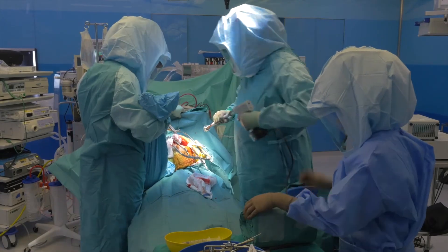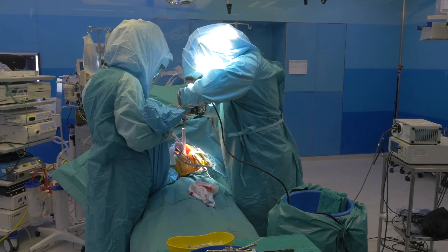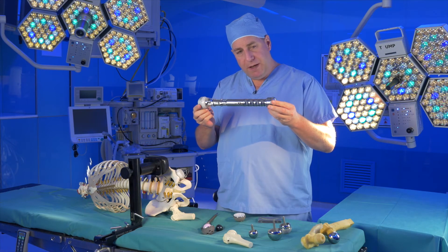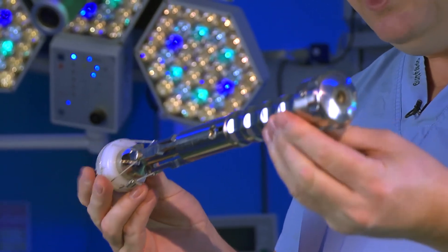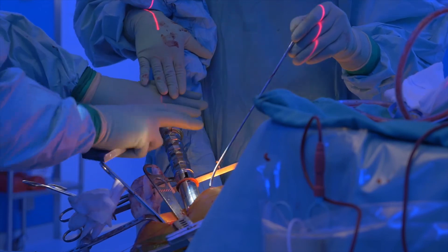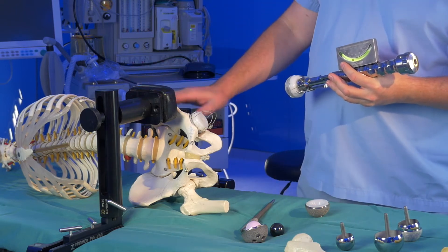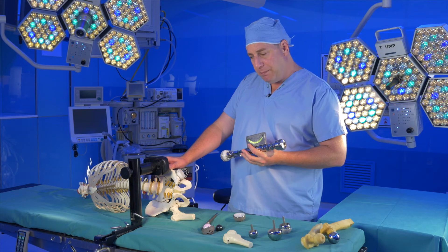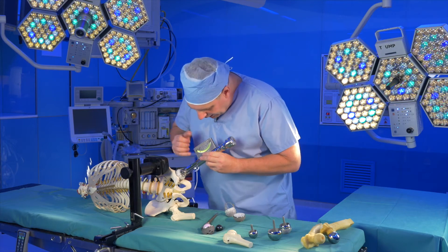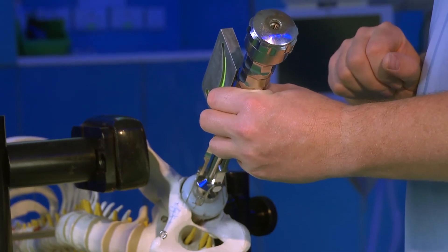Once the hip joint is exposed, the acetabulum is reamed out to make space for the acetabular cup. In order to get the acetabular cup and the resurfacing in the right position, we use the standard instruments with the addition of a spirit level and a laser guide. We position the patient very carefully on the table to get the pelvis in the right place, and then we place the cup using the spirit level and laser guide to put it in what we think is the right place.